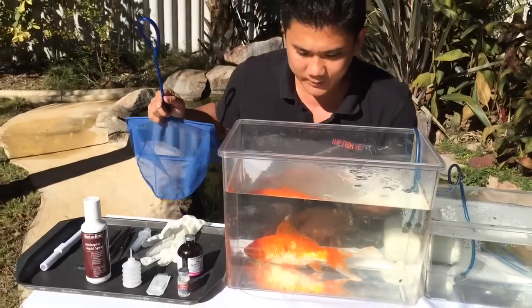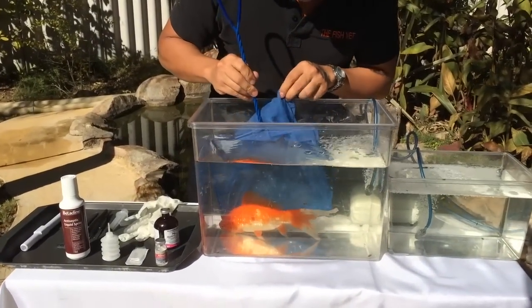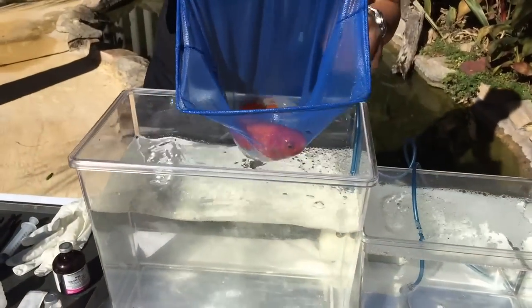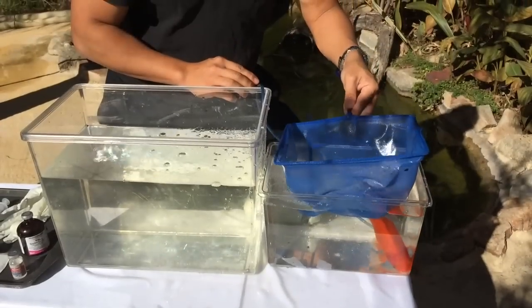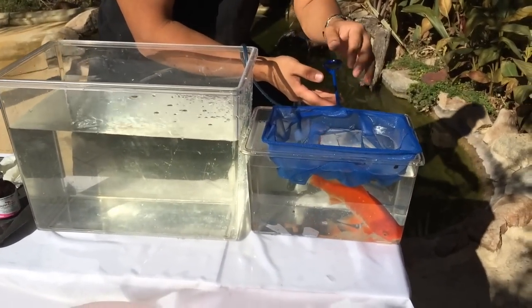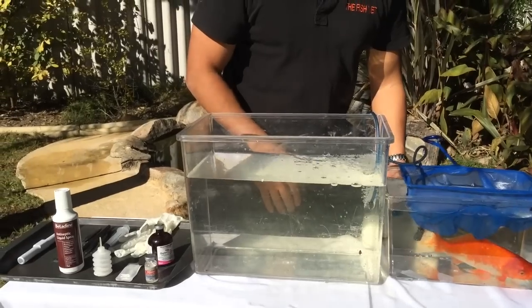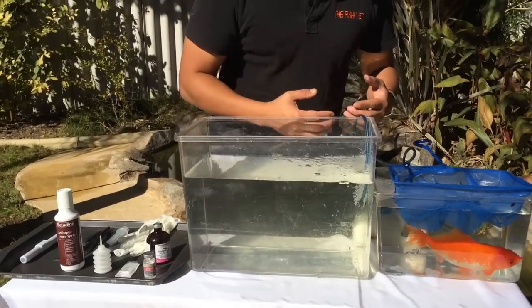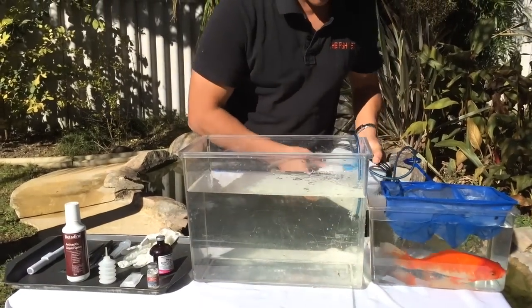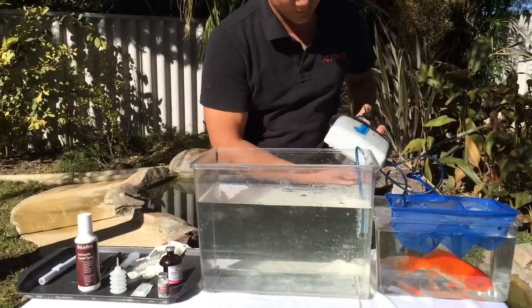Right, so we're going to transfer the goldfish Bruce into the anesthetic bath. Just maintain — keep a lid or a net over the top to make sure he doesn't jump out. Whenever you're working with water, it's good to have battery-operated pumps. Here I've got a battery-operated pump, so it's unlikely that you're going to get electrocuted with water splashes.